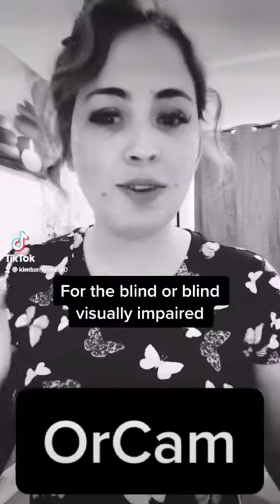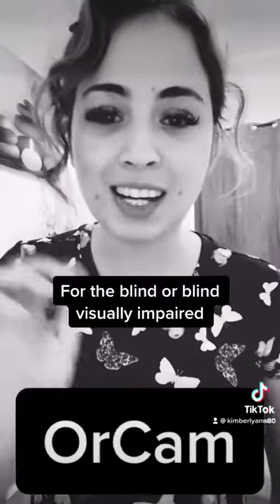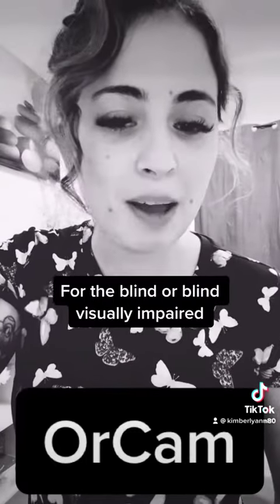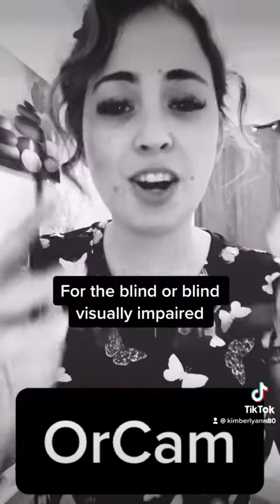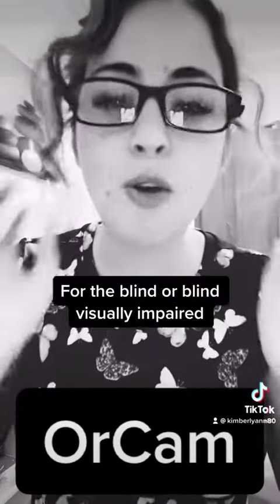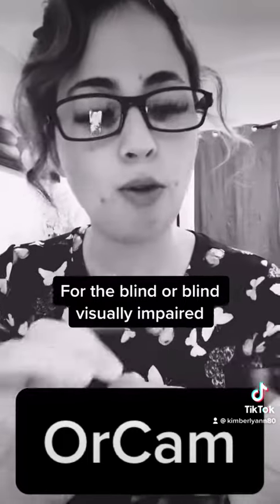Hey guys, so I got to use my OrCam for the first time and I wanted to show you some clips of me using it. But before I do that, I want to show you the glasses it came with — I cannot see out of these, they're just there to hold the OrCam. It clips on with a magnet.